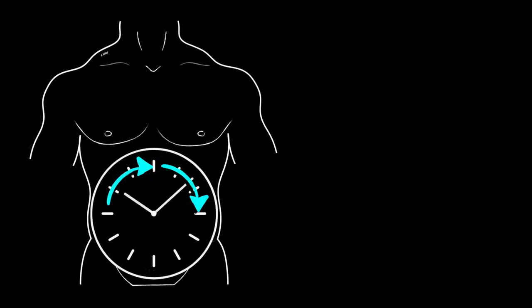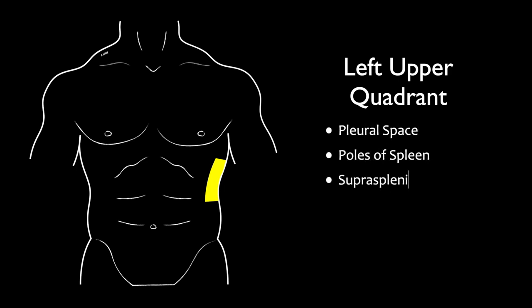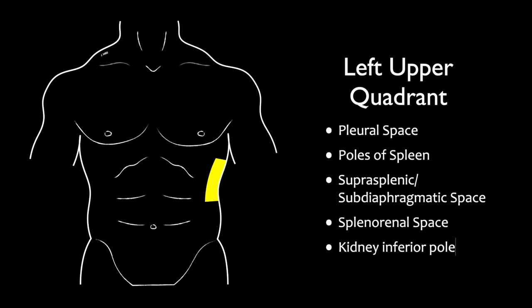After finishing the sub-xiphoid view, we continue clockwise to the left upper quadrant. The left upper quadrant is more difficult than the right — because the spleen is so much smaller, you can't use the anterior abdomen. You really need to get very posterior on these patients. I like to go all the way to the posterior axillary line, fan a little bit anterior, and if I don't see the spleen, drag the probe just slightly anterior. We're going to evaluate from the pleural space all the way to the inferior pole of the kidney and spleen.